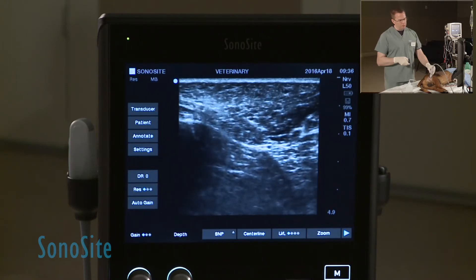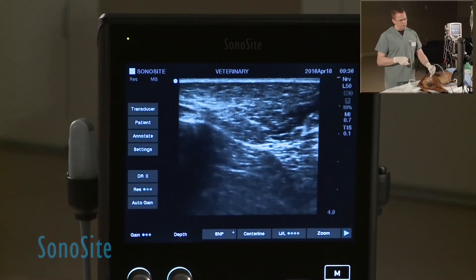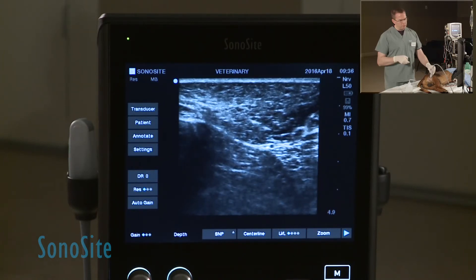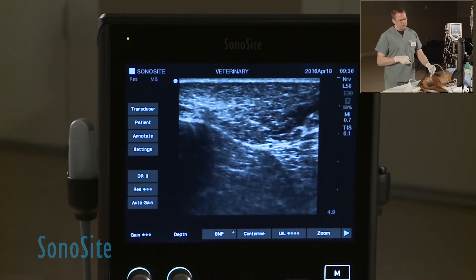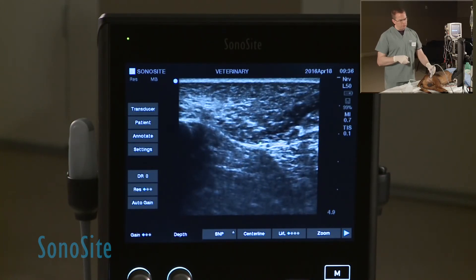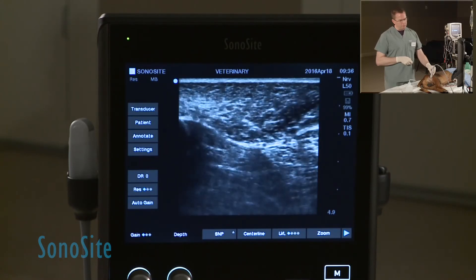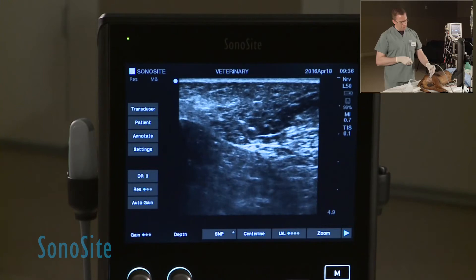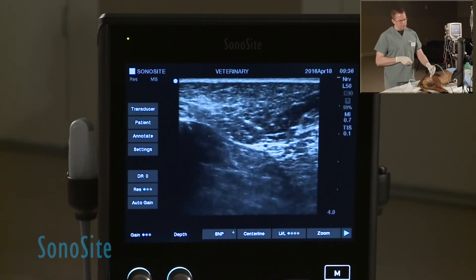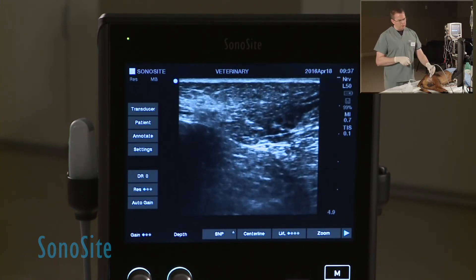The more caudal structure is a little bit larger than the cranial piece of the sciatic nerve — the tibial component is the one caudally, and the peroneal component is the one more cranial. As we move up and down the leg a little bit, you can see that is a continuous structure that we can identify at that deepest point.